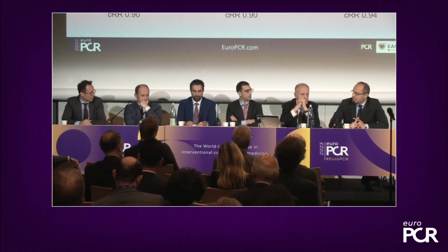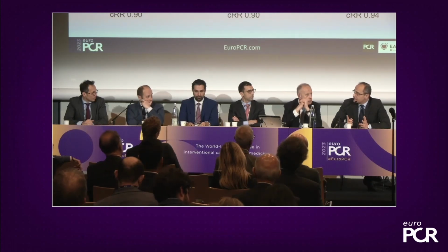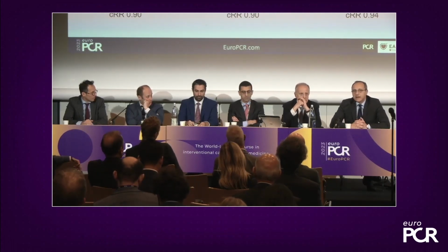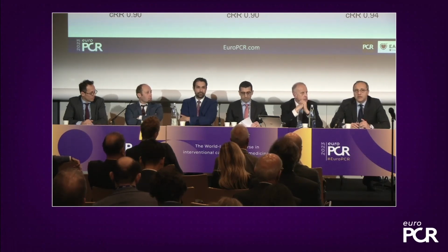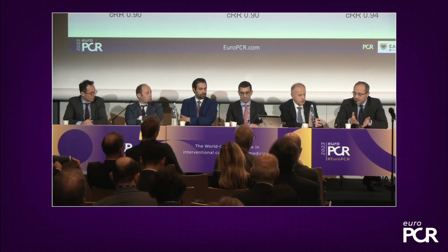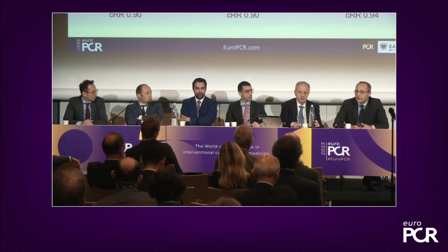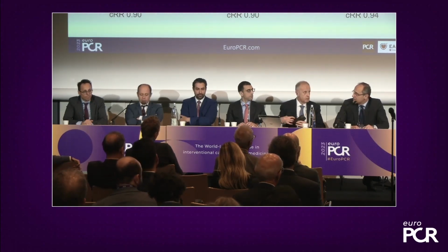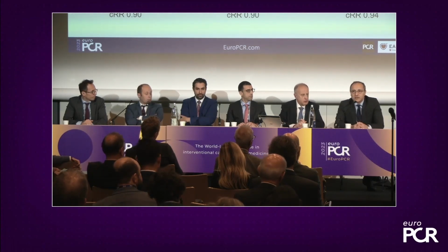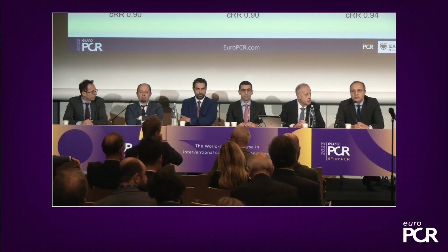Secondly, this device seems to make our life easier, because we can go back again within the vessel, having just entered the vessel safely, without major problems, and again very quickly. So we can assess multivessel disease, complex coronary anatomy, calcified lesions. We're looking forward to seeing the results that will be available, I guess, in a couple of years from now, of the INSIGHTFUL FFR trial, to see whether we also have solid data to substantiate our reasoning today. With this, I thank you very much, and I wish you a good evening and a good continuation of EuroPCR. Thank you.